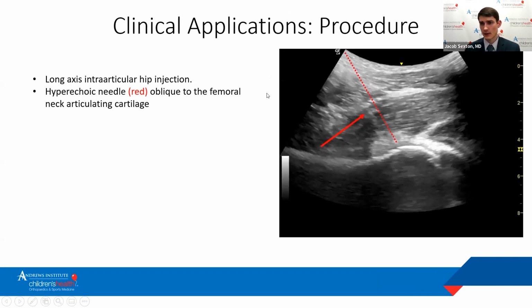So how else is this useful? Probably one of the biggest helps for us is kind of diagnostic ultrasound procedures. It allows us to accurately move needles, move instruments into anatomical structures with pretty significant accuracy. Multiple studies have shown that there are better outcomes and more improved accuracy using ultrasound guidance for corticosteroid injections and other procedures as compared to palpation guided alone.